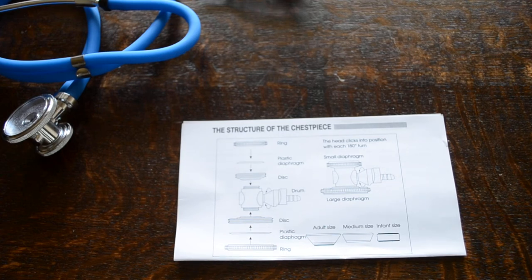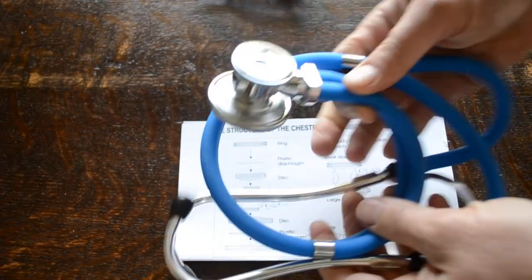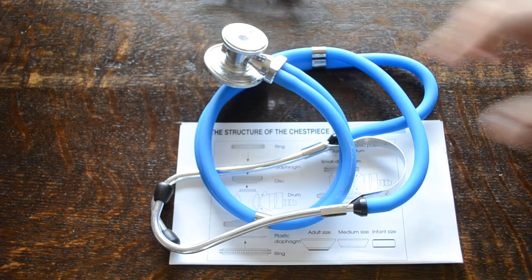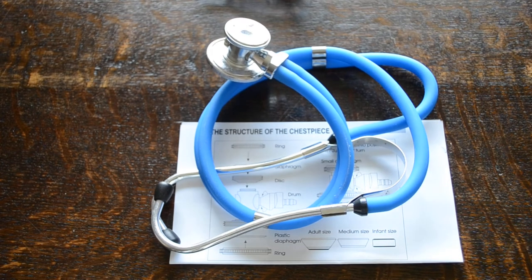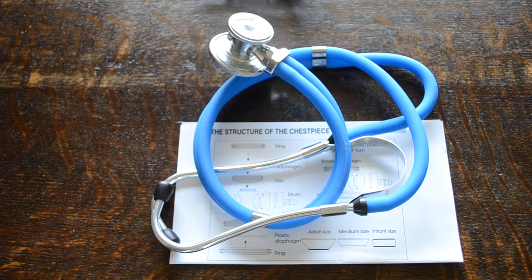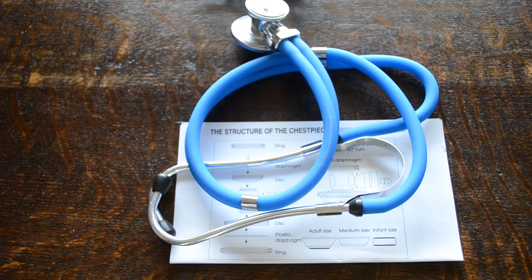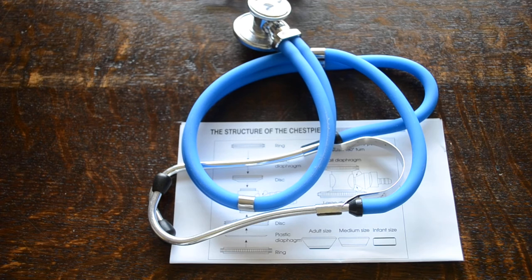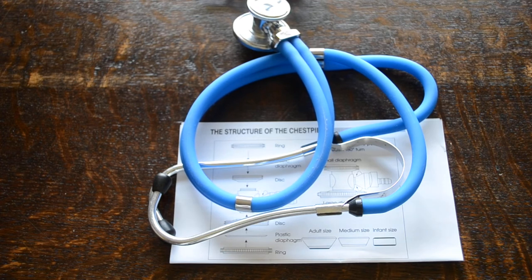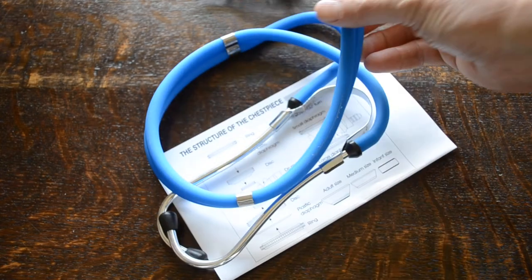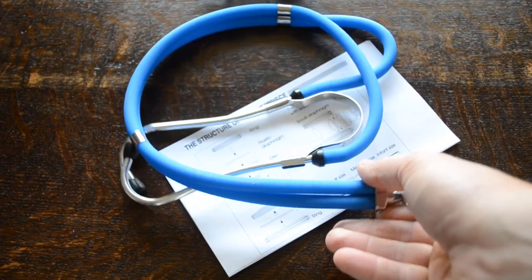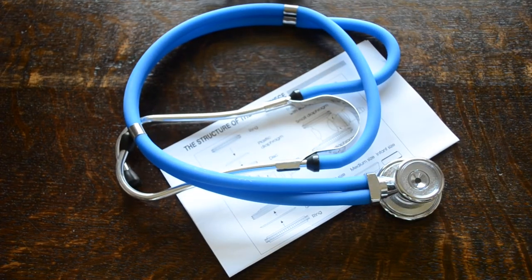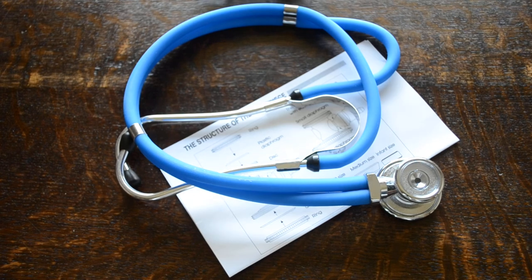So that's the Valumed Blue Tube Sprague Rappaport stethoscope. These units only cost around £9.95 with delivery. In the UK you're looking at £12-£13 depending on your preferred delivery route. So it offers extremely good value for money and very good auscultation quality in clinical daily use. It's going to stand out from the crowd. It's not your standard stethoscope, but really is when it comes to listening to chest and hearts. A really good quality piece of kit available from valumed.co.uk.